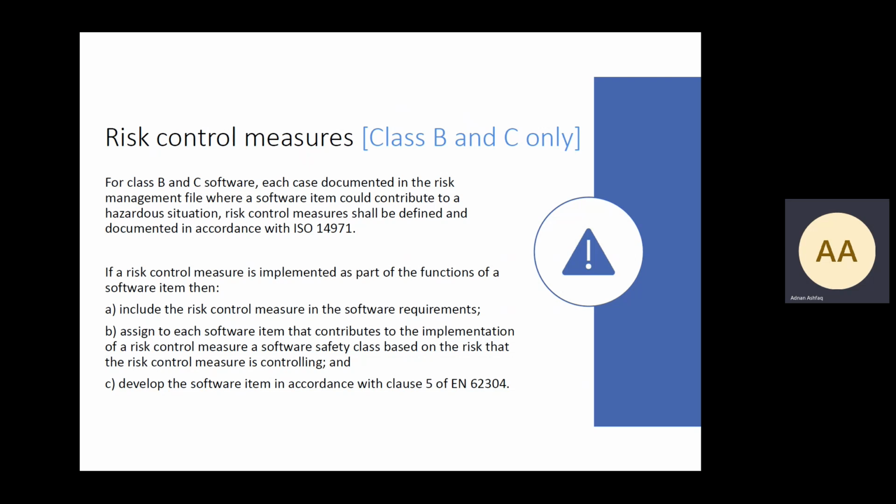Then we have risk control measures, again class B and C, but maybe also worthwhile having a look at just as a general exercise for risk management, even if it's a class A. My advice is to still perform this activity.